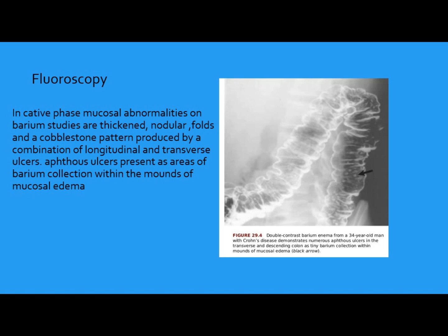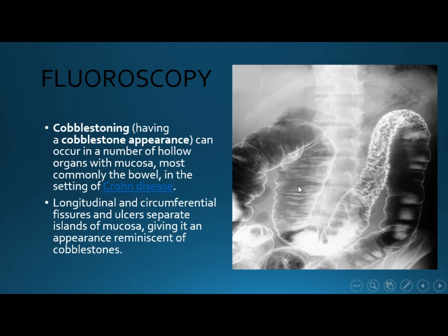After ultrasound, we can use fluoroscopy. The barium study is a general x-ray. In the acute phase, we have shallow ulcers which appear like nodules. This is a double-contrast barium study of the transverse and descending colon. The cobblestone appearance is caused by longitudinal and circumferential fissures crossing each other, and this pattern of ulceration appears as a cobblestone appearance.